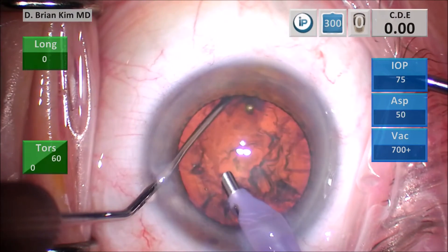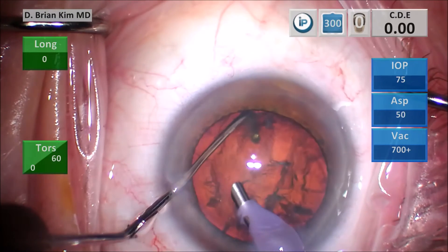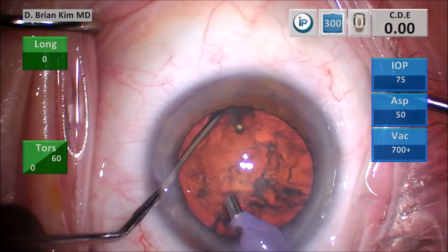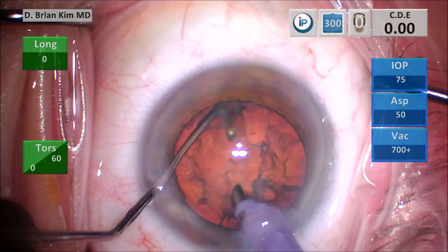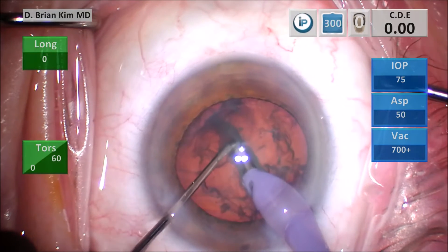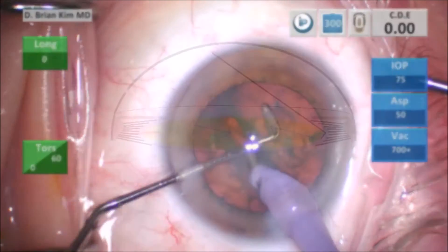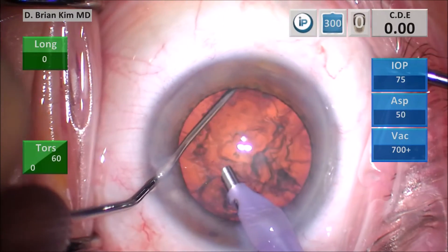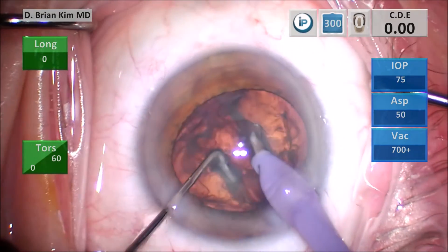The chopper is out to the equator in typical horizontal chopping fashion, but I'm supinating my hand and rotating and tilting that chopper tip upward. You can see I'm lifting the lens up and if I pull any harder it's going to come out of the bag. As I'm lifting, the lens is being supported from below, and then I push down on the facotip into the lens material and it divides the lens. This is a purely mechanical technique — going from below and having both instruments meet. I'm lifting the lens first with the chopper, then driving the facotip into the lens and breaking it.